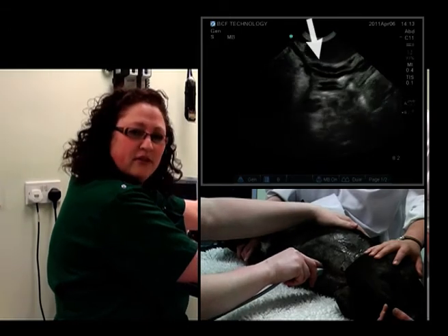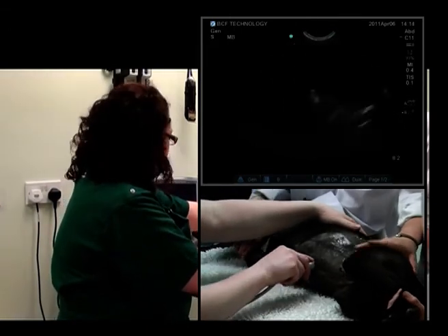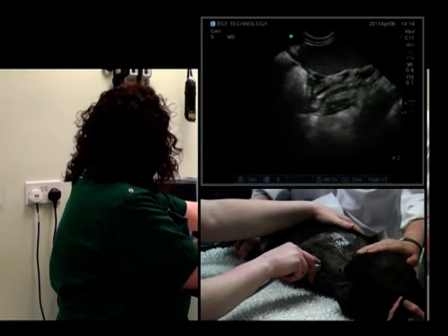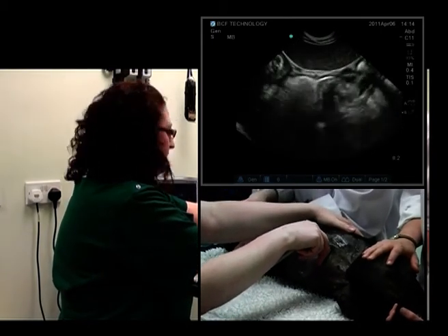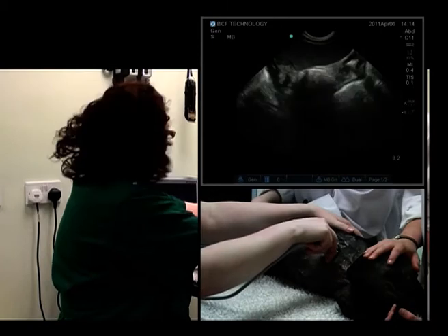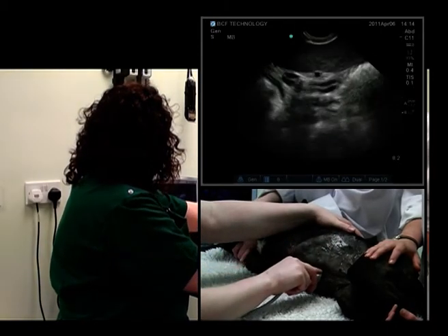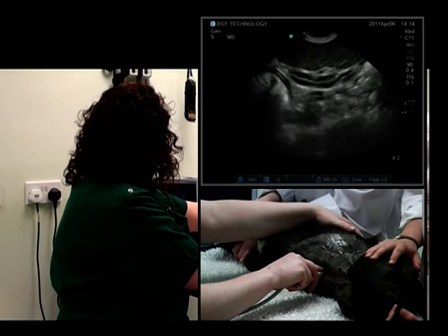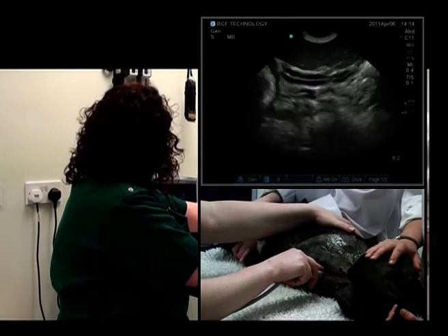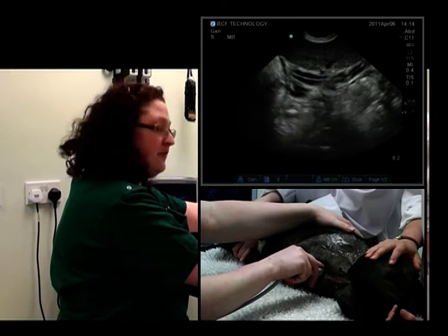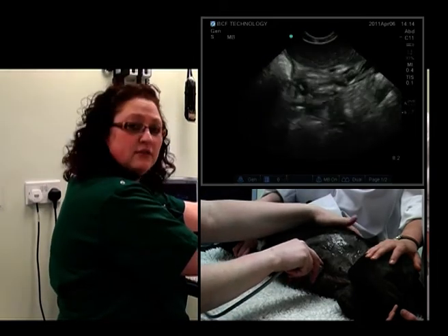And there are some loops coming in just caudal to the stomach. So we'll slide along and can stop to look at any loops that take our interest. At this point, we could perform measurements and calculations of wall thickness.